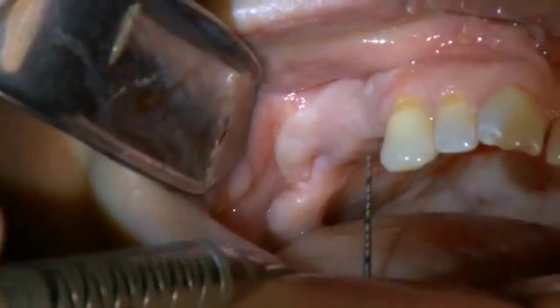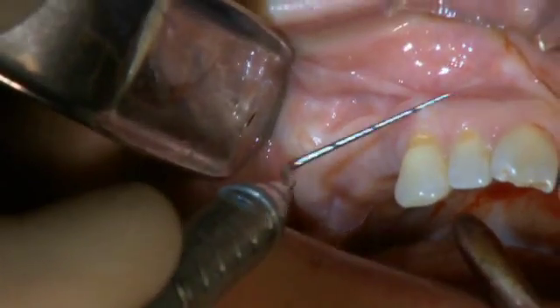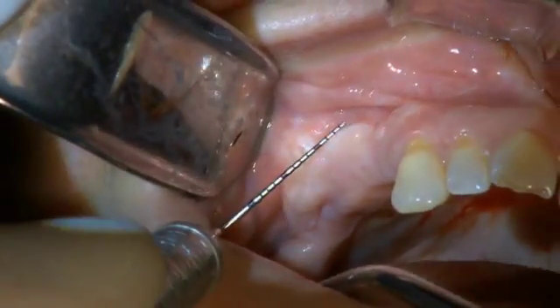On the contralateral side, where we did the same surgery a few months ago, we now see a beautiful increase of the vestibule and the keratinized tissue.